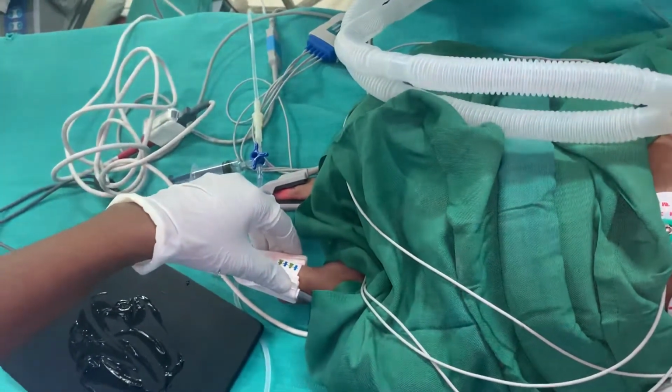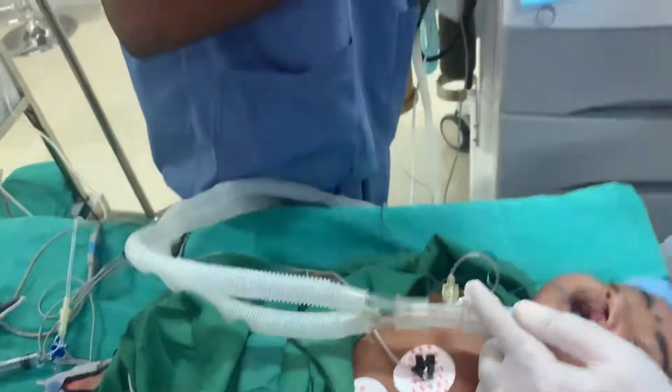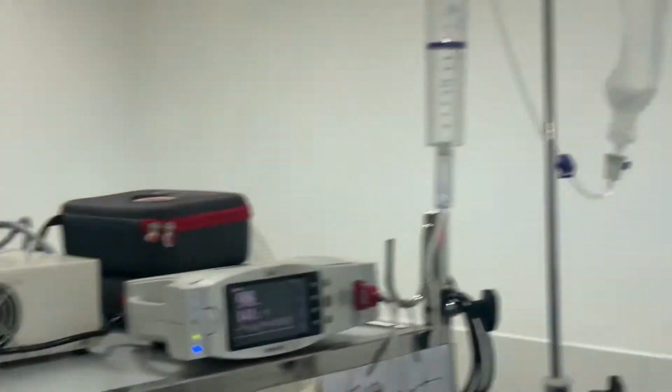So the probes of the pulse oximeter readings. There's one there and another one there.